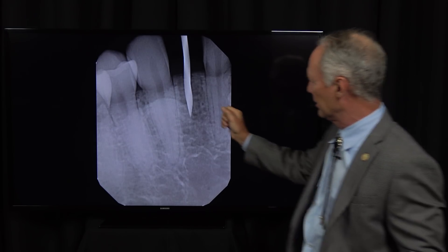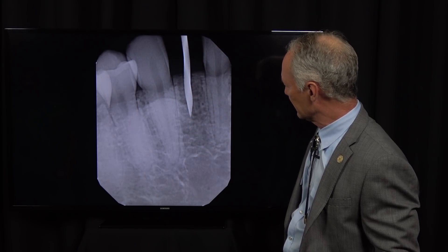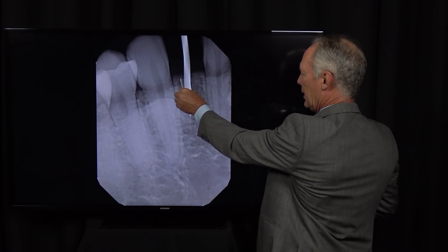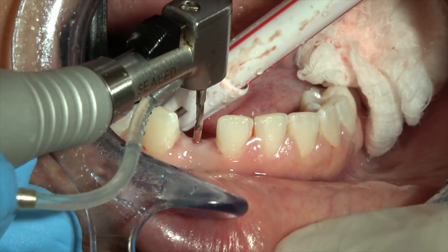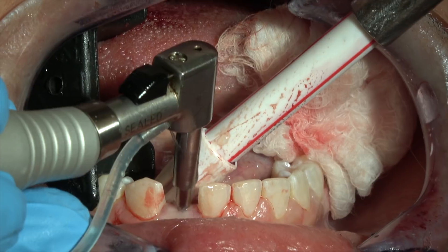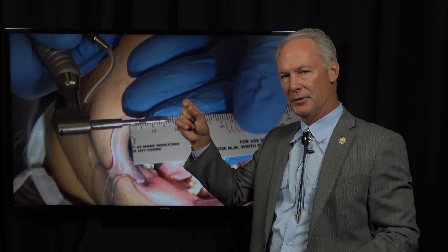I'm only part way in to be sure the drill is not going off to either side. That looks very good — I may angle it just a tiny bit. But don't get in a hurry. The work we're discussing in the Dental Minute and Dentistry Master Classes is low-volume work because it's very critical that you get it right. That's about 17 millimeters. In this case I'm actually drilling to depth because I'm going to place a larger implant — a 2.5 or a 2.9, not a 2.0. The 2.5 and 2.9 won't self-advance in the mandible's dense bone if you don't drill to depth.